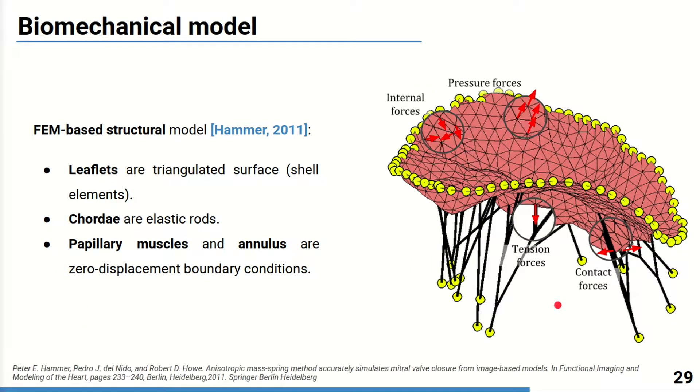For the simulation we used a structural finite element based model. The leaflets are represented as triangles and chordae as elastic rods. Points corresponding to the papillary muscles and annulus displayed in yellow were modeled as zero displacement points.